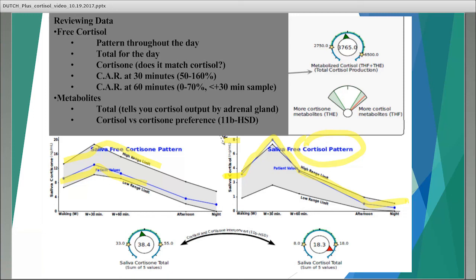And if we want to ask further, well, okay, is there a preference for active cortisol? So the deactivating of cortisol to cortisone, if you have a favoring of the opposite to where it's staying in that active form, and that's what we can see here, that happens with inflammation, and hypothyroidism is very common.